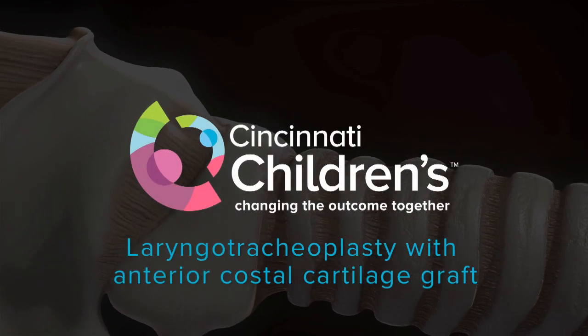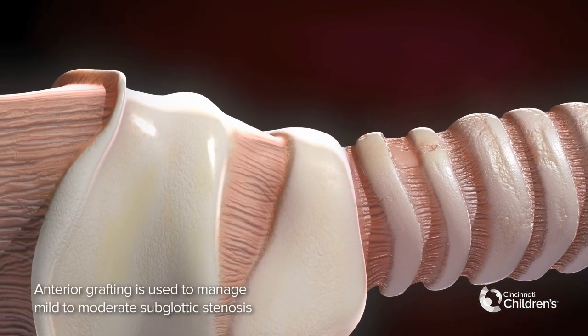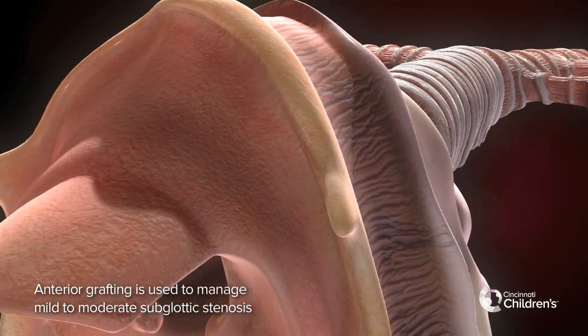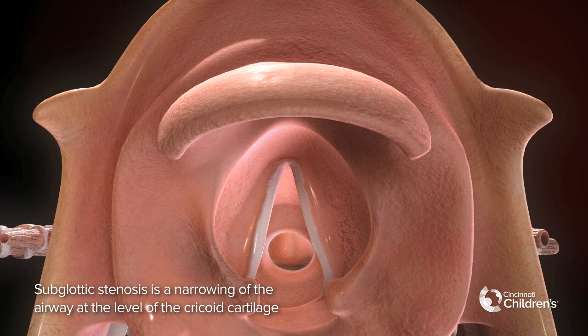Laryngotracheoplasty with anterior costal cartilage graft. Anterior grafting is used to manage mild to moderate subglottic stenosis. Subglottic stenosis is a narrowing of the airway at the level of the cricoid cartilage.